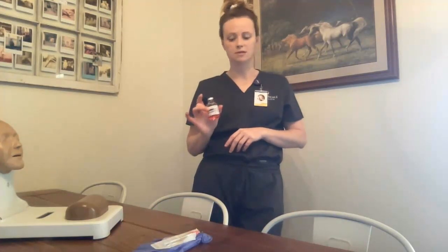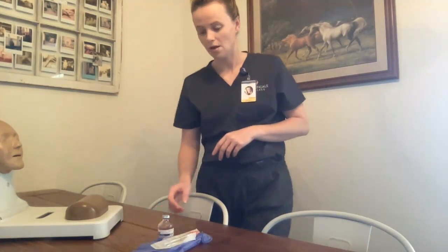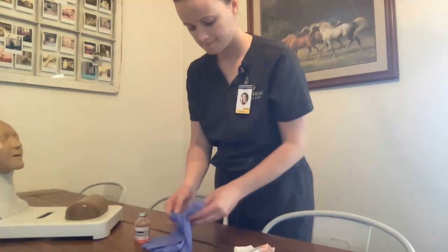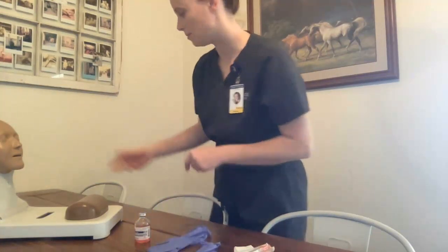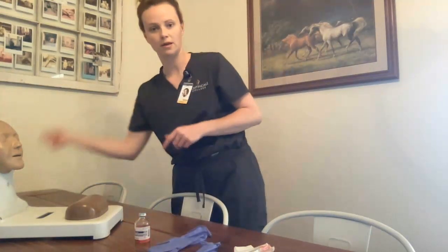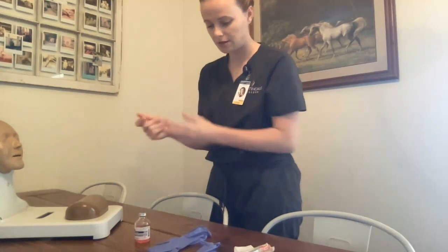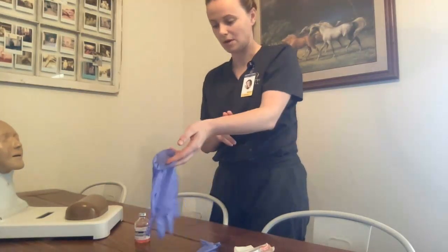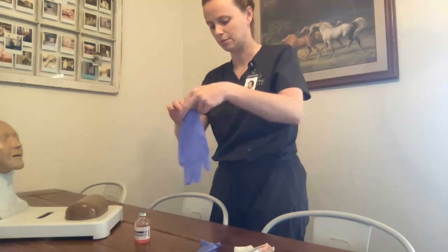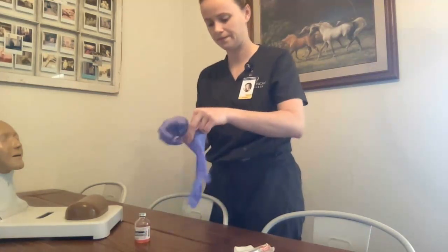This will be my third time verifying the medication against the MAR. I also want to let you know, Mrs. Smith — hand hygiene — that upon injection of the medication, it is unfortunately common that you might feel some stinging or burning at the site. I just want to make you aware of that.